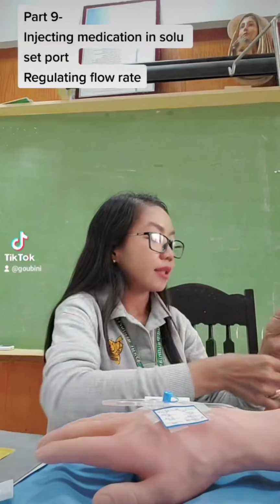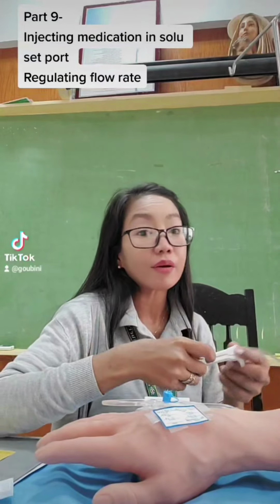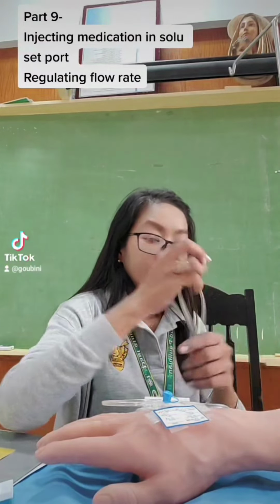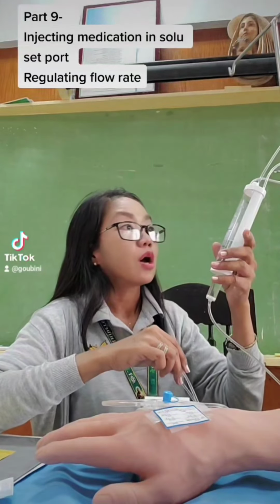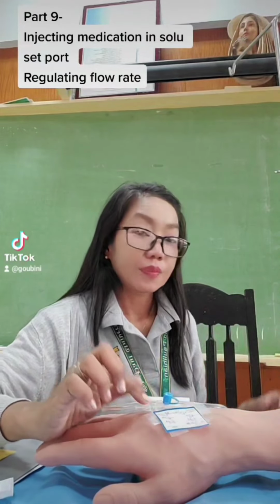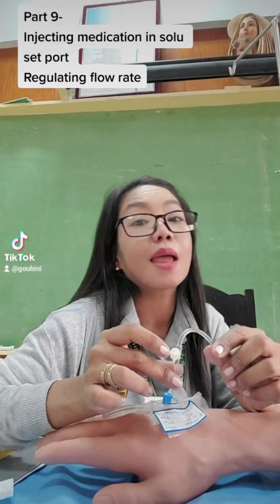And then make sure that there is no air inside your IV lines. The end part of this soluset, you will inject to the port of this main line.